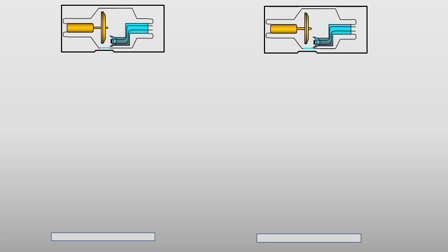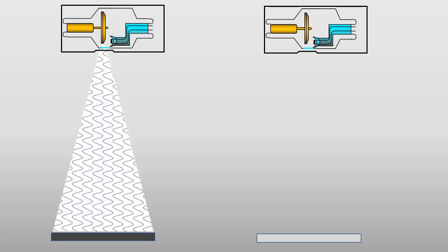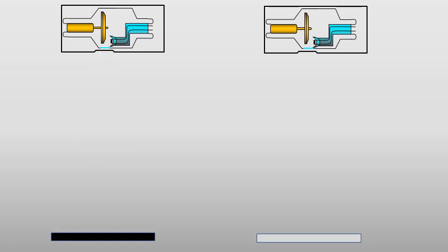Let us repeat the previous example with an additional twist. We will fire the two X-ray beams for a set amount of time. The beam on the left will expose the image receptor for exactly 2 seconds, and the beam on the right for exactly 1 second.